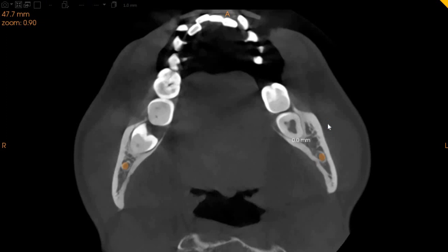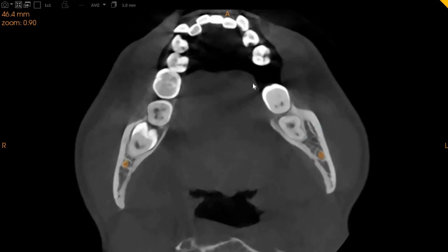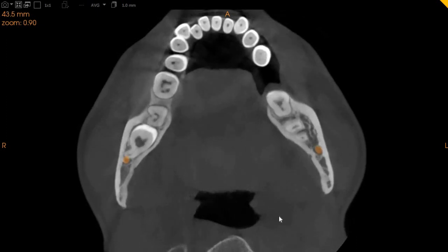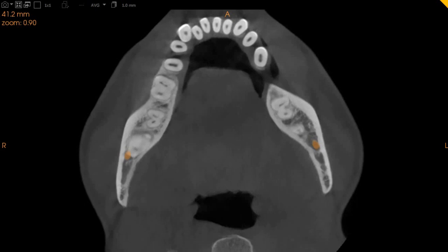This is the axial view — this is the tooth in question. Here you can very clearly see that the apex comes close to the inferior alveolar nerve, but it does not at any point come in contact or cause any compression.